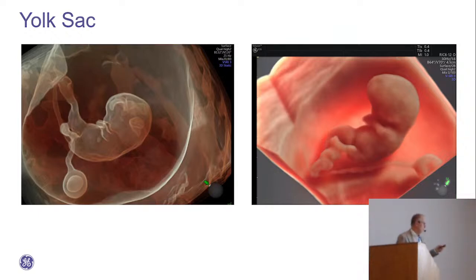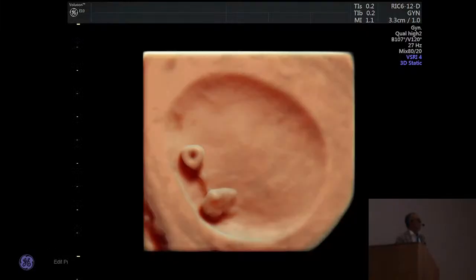And look how nicely you have this, the yolk sac in 3D, and also over here. And what is also very interesting is to see this vitelline duct. And what you could try, because we also had some more discussions about the new technology, B-flow. If you scan, because also with B-flow you don't increase the mechanical index, so it's very safe to use because it's the same as you do in a normal 2D image. Try, when you see the vitelline duct very nicely, to use B-flow. It's really interesting to see. And look at this one. So all done with one sweep.